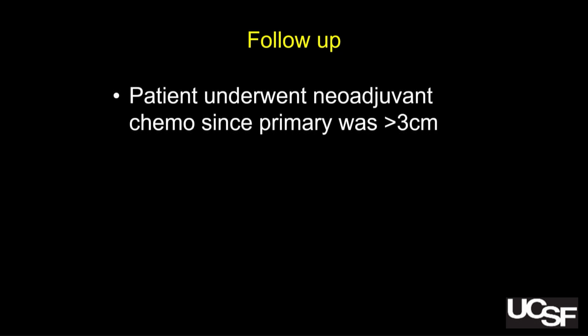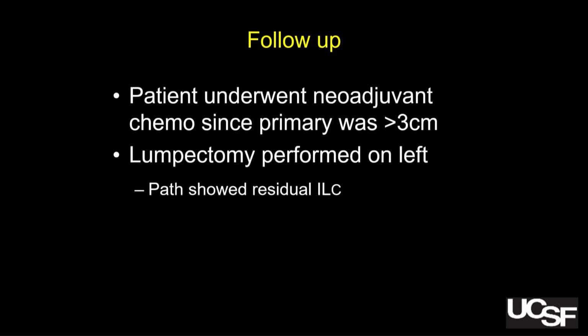So this is where it can get a little bit more challenging. But you work with it. So luckily these days we also are doing more monitoring of high-risk lesions. Now note, this is all under supervision. So the patient's under the care of a surgeon and an oncologist. It's shared decision-making, but we also do radiologic pathologic correlation.